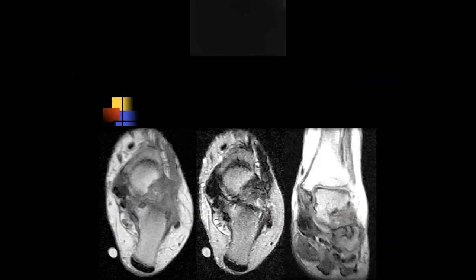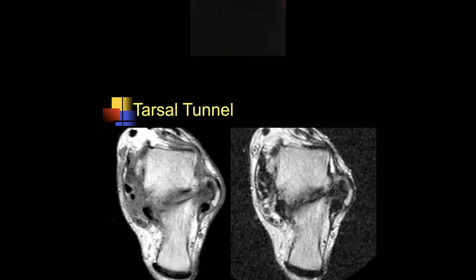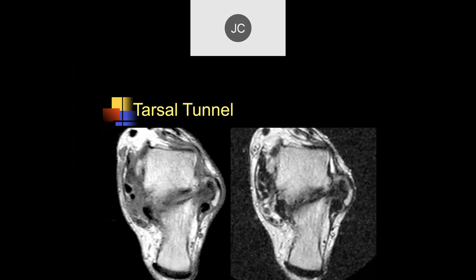I think in this particular case, well, this is a different case, but somewhere, I think this patient had rheumatoid arthritis. This was all pannus from rheumatoid arthritis. But here's another patient who had similar symptoms. Tayson, what do you think about this patient?